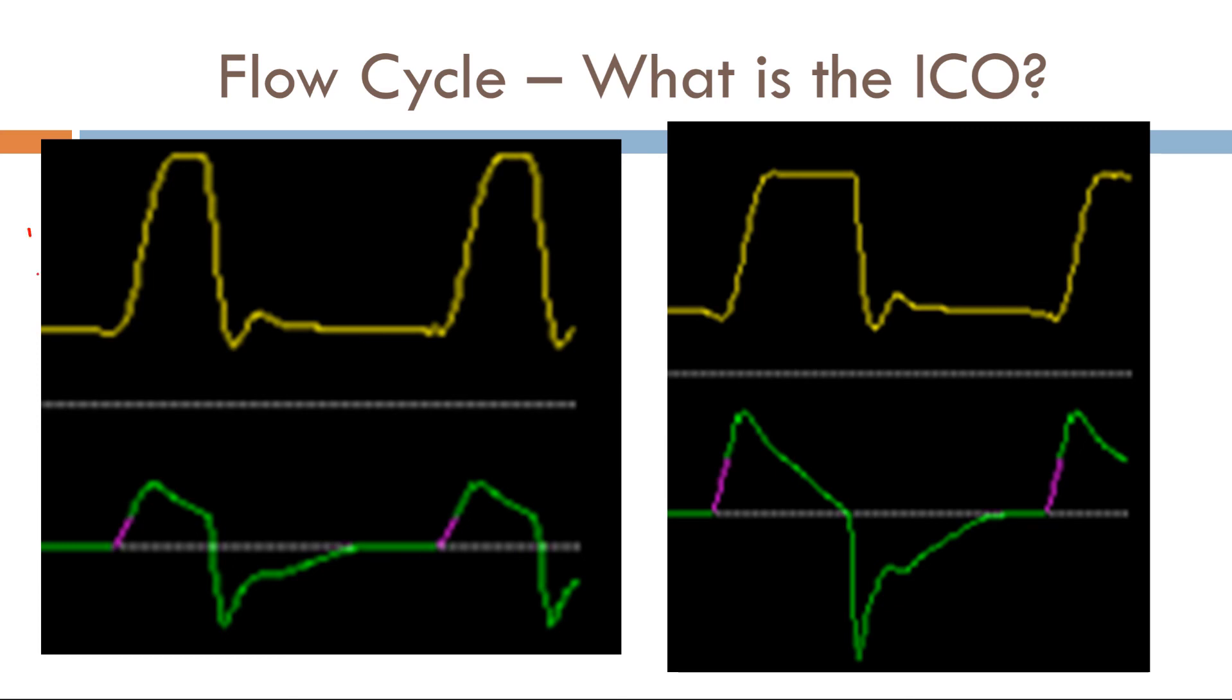Okay, so let's take a quick look. Here's our pressure scaler. Here's our flow scaler. So the way we determine the ICO or the inspiratory cycle off is by looking at the flow scaler, determining what 100% is, which is right here. So right here is where the breath stops right around here. So right here I would say this is about 50% of the peak inspiratory flow. So ICO here I would say is 50%. Let's contrast that with here.